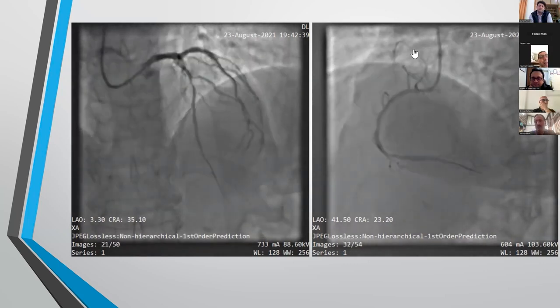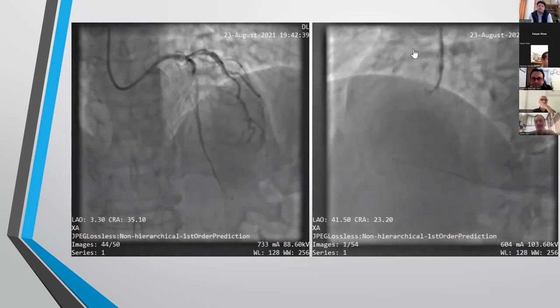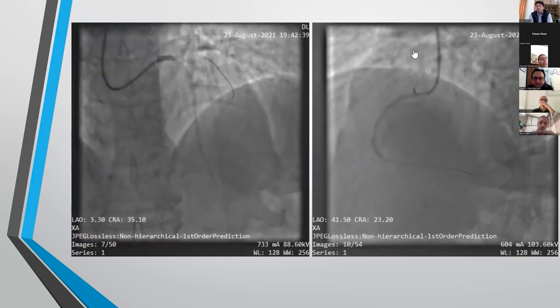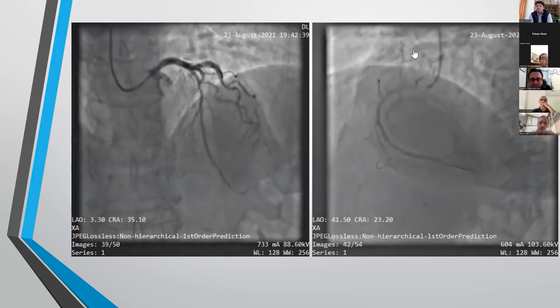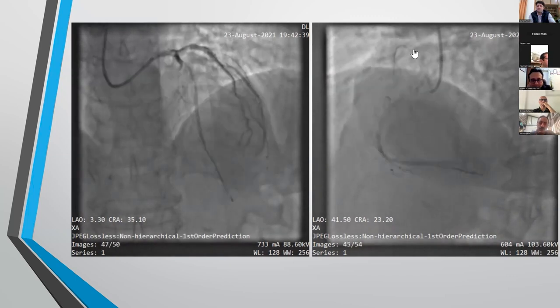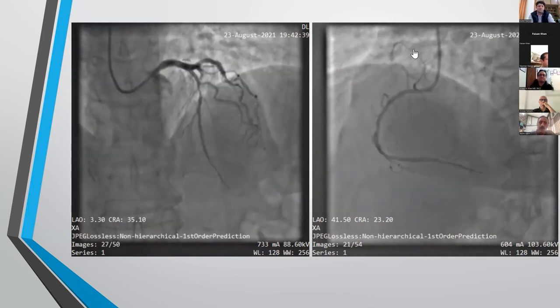Yeah, you should have to after fixing that. It's better to fix it and then do it and then decide about that vessel. Absolutely. Last quick comment I would like to give, that it is very important to know all the pitfalls of FFR and IFR before really, right?